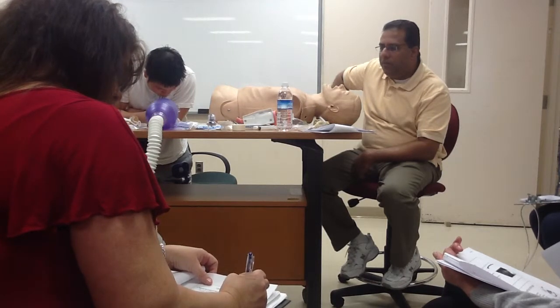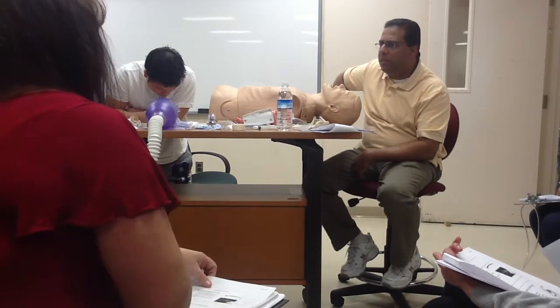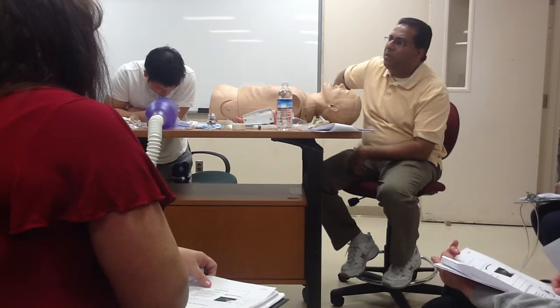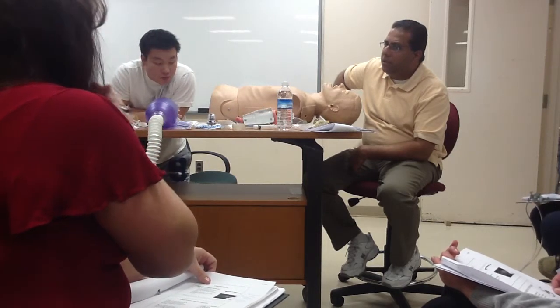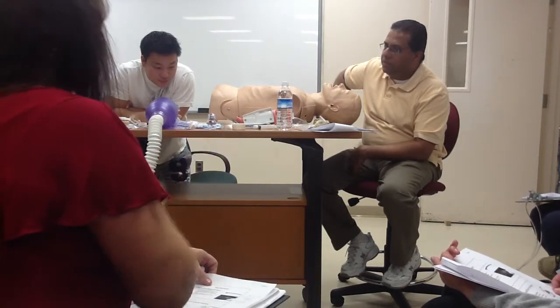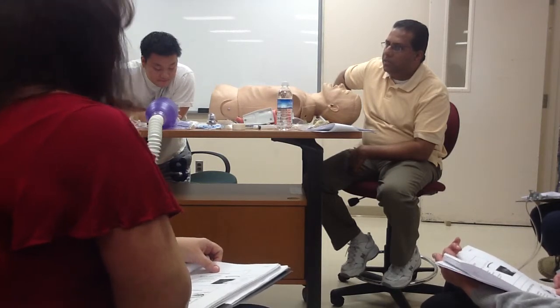We don't have a whole lot of patients that have a nasopharyngeal airway stuck in and left there. Sometimes we leave it for 24 hours, then we take it out. But if you had a patient with something wrong with the upper airway, like an injury or dental surgery, you would use it, right? Yes. Mainly we use it for suctioning. That's what we use it for.